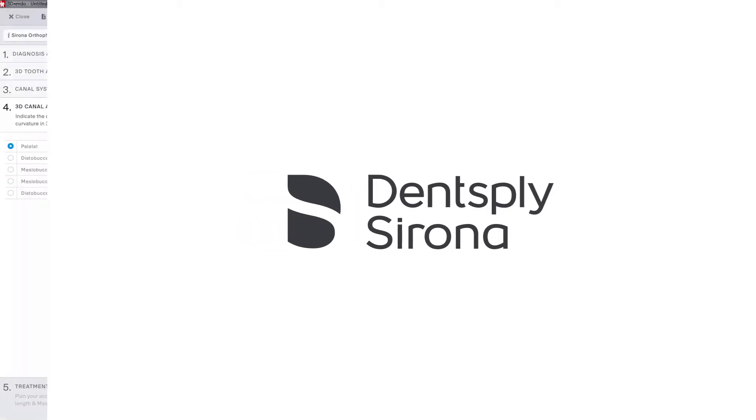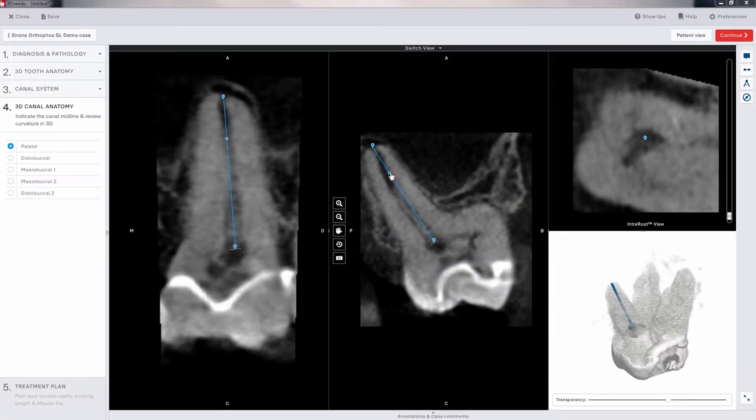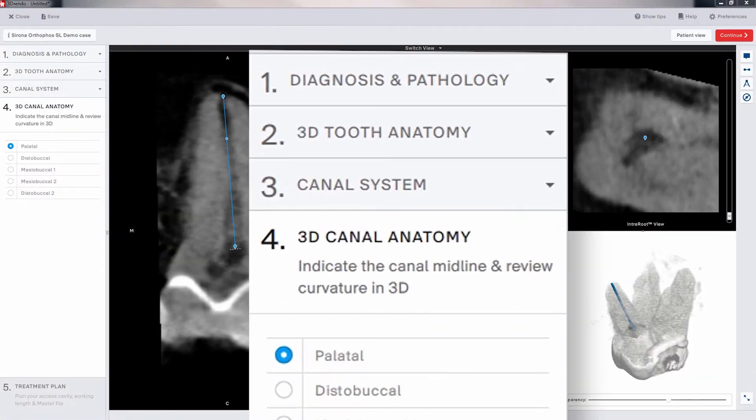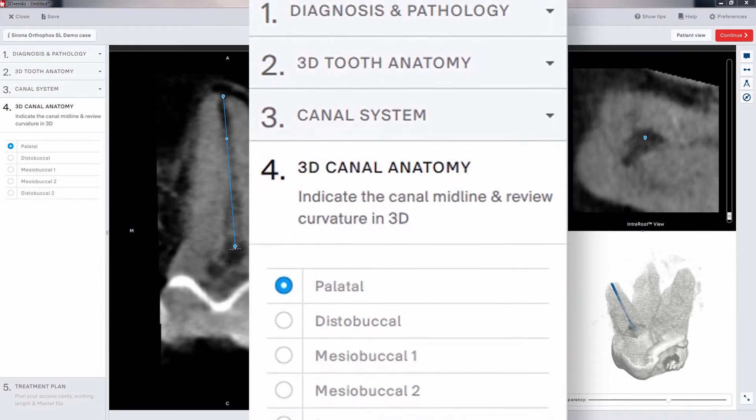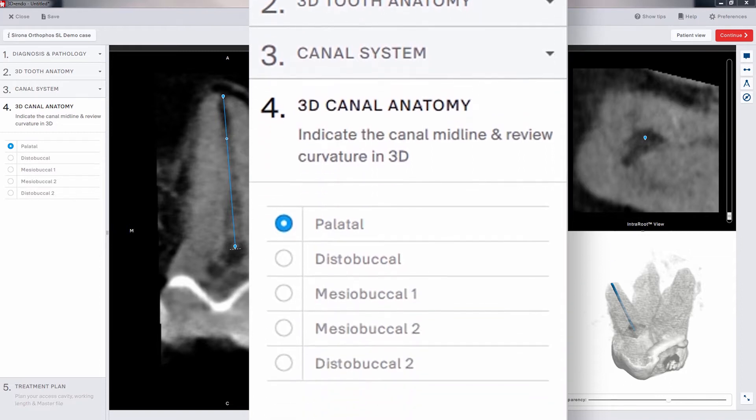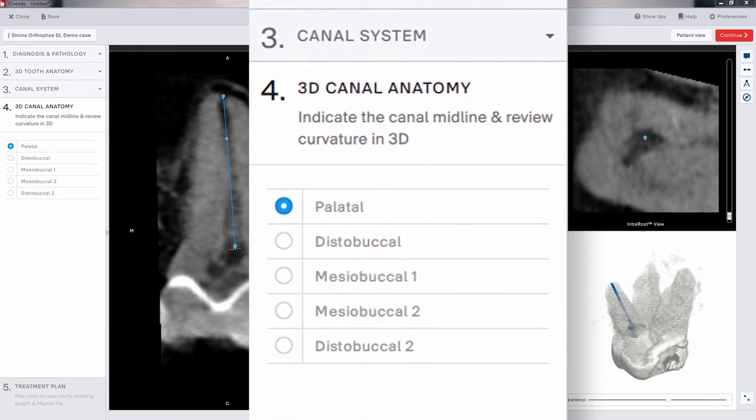3D Endo software takes you step-by-step through the treatment planning process. The fourth step of the process is where we will define the trajectory between the previously identified entrance and apex of each canal.